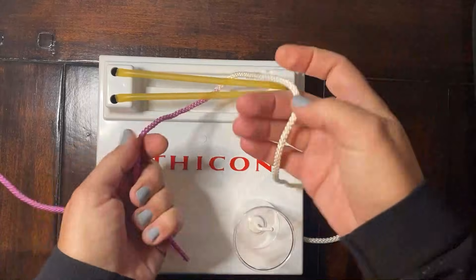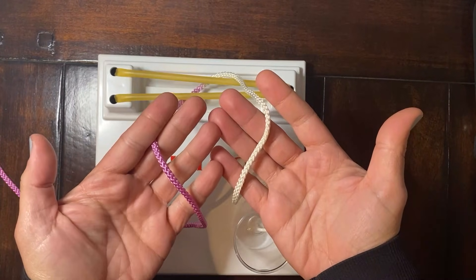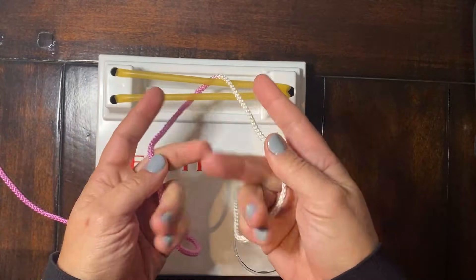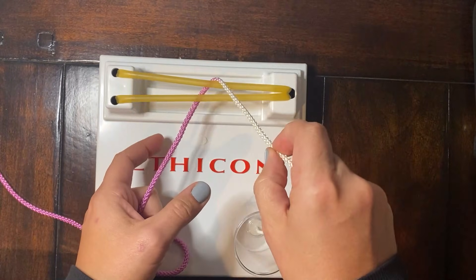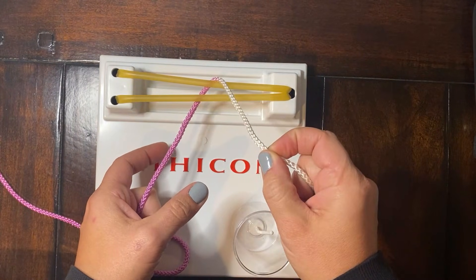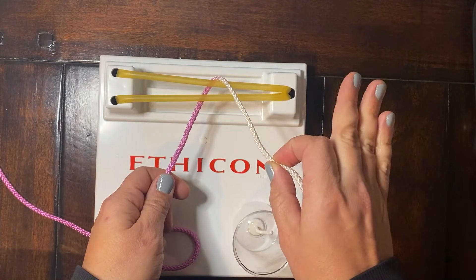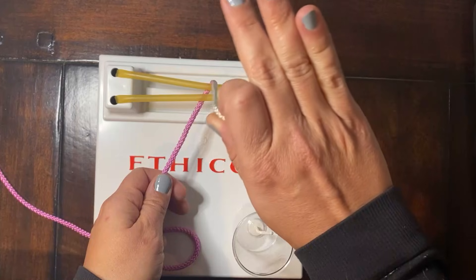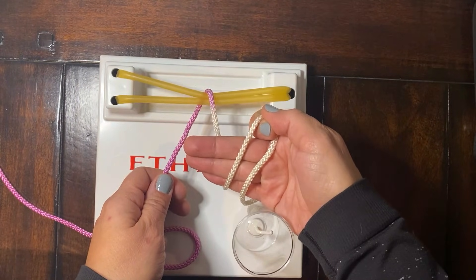The right hand is going to do most of the work here. The left hand is what we call our post. So we'll start on our pistol grip, as we do with most knot tying techniques. Our first move is to pinch the suture between your index finger and thumb on the right side, then let go with those last three fingers. You're going to come above the suture, rotate your hand, and chop down on it.